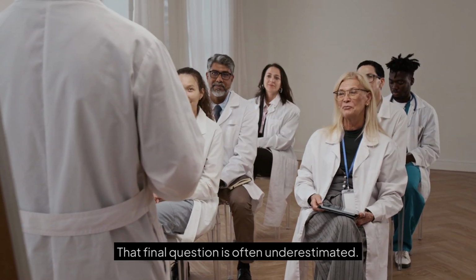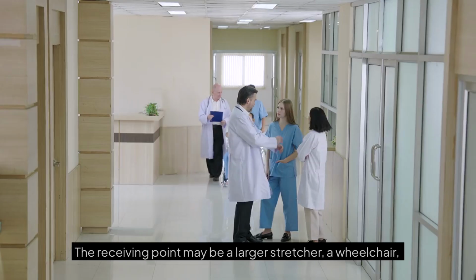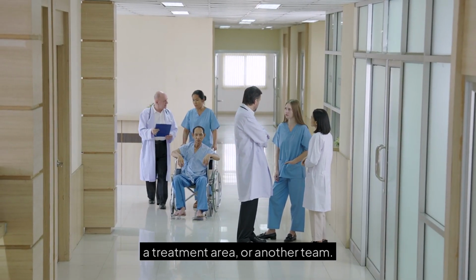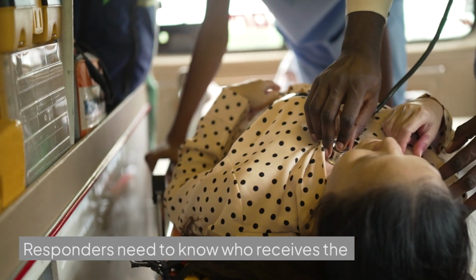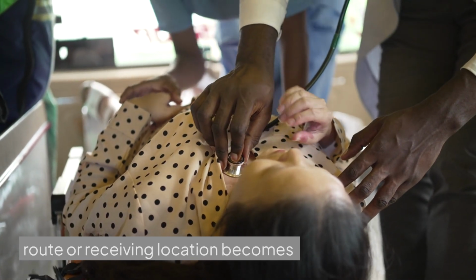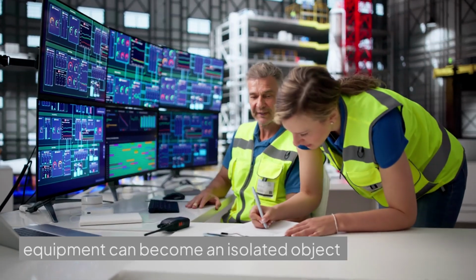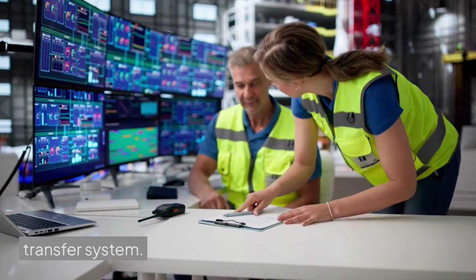That final question is often underestimated. A patient movement does not end at a doorway or vehicle. The receiving point may be a larger stretcher, a wheelchair, a treatment area, or another team. Responders need to know who receives the patient, what equipment is ready at that point, and what happens if the planned route or receiving location becomes unavailable. Without that handover plan, portable equipment can become an isolated object rather than part of a coordinated patient transfer system.